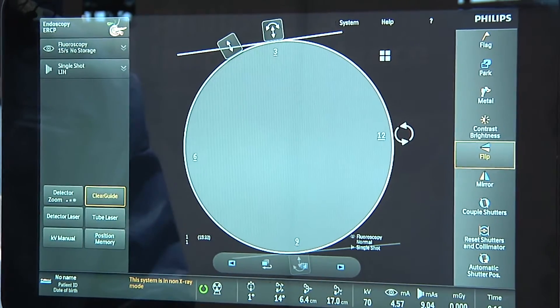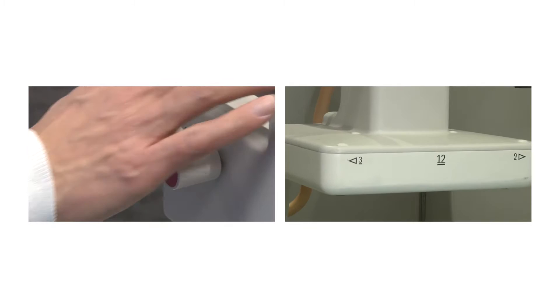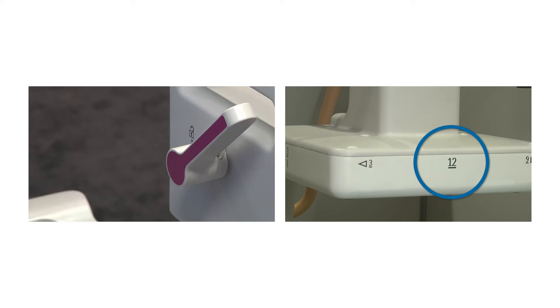The numbers and the colors for the Clear Guide — I thought those were really neat. Obviously some people will say go up, some people will say go north, some people will say cranial. So to be able to say go towards the 3, go towards the 9 — I think that is a neat feature.